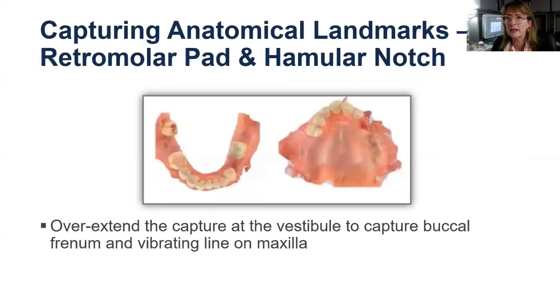So we talked a little bit about the importance of capturing those anatomical landmarks, the retromolar pad, the hamular notch. Overextend the capture at the vestibules to make certain that you are capturing the vibrating line as well, where the post dam area of the maxillary denture is going to be. That's critically important for adequate retention.